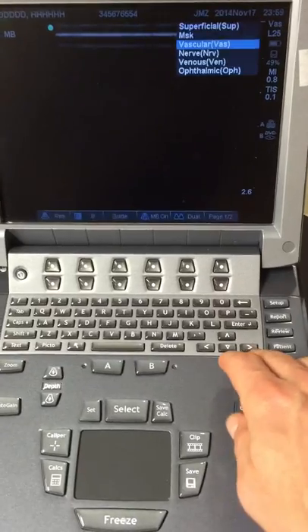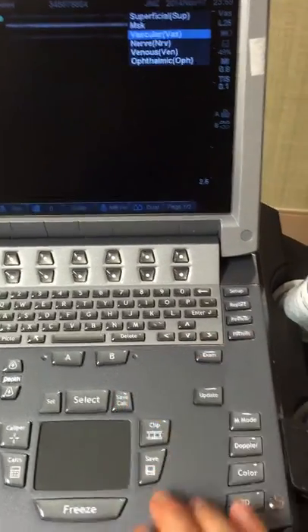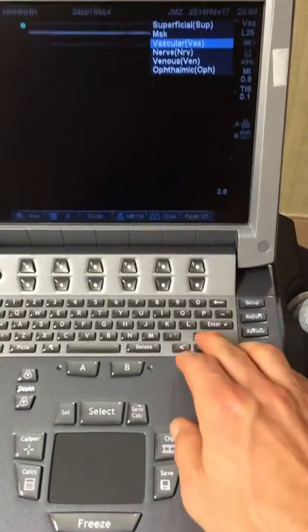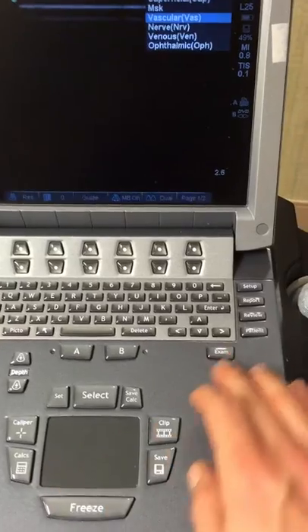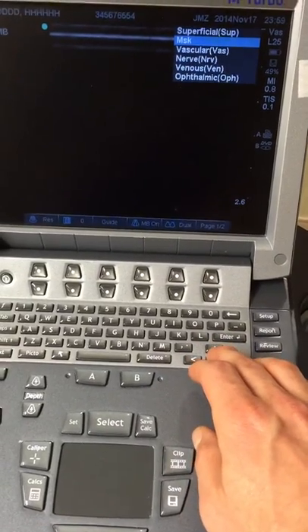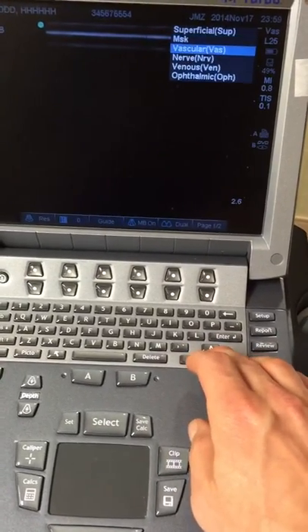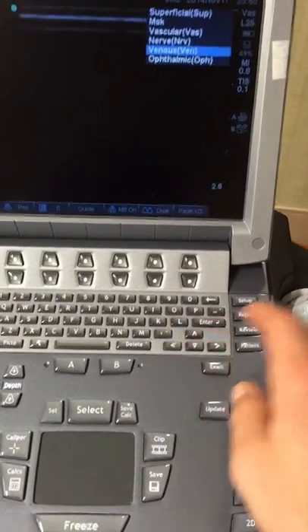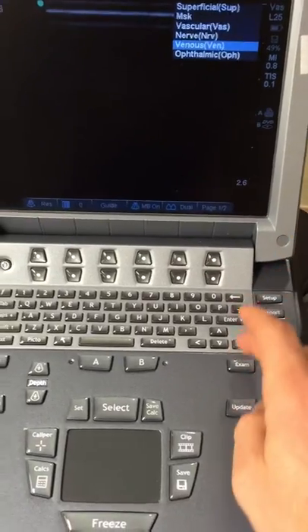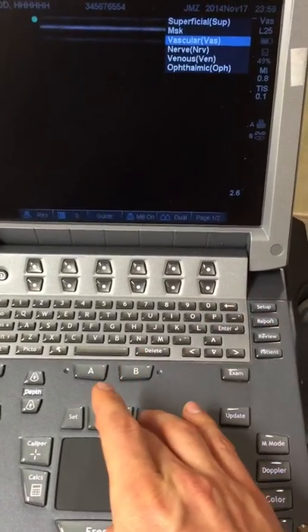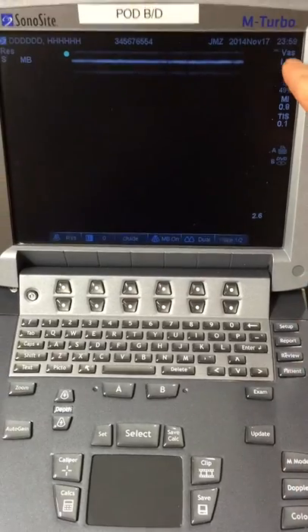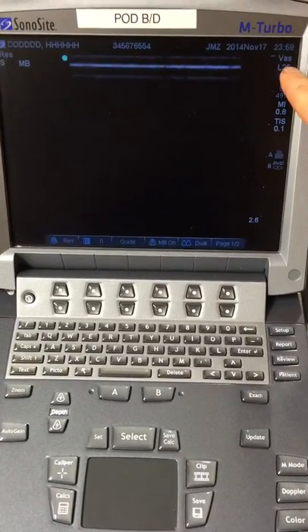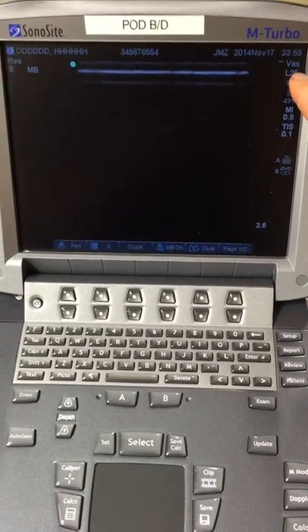Hit exam, and then you can see you can click through, either with the arrows or the mouse, depending on what you're doing: musculoskeletal, vascular, nerve, etc. And then you can pick the one you want. So we'll pick vascular, hit select. And then that will switch up here, and the presets will be there.